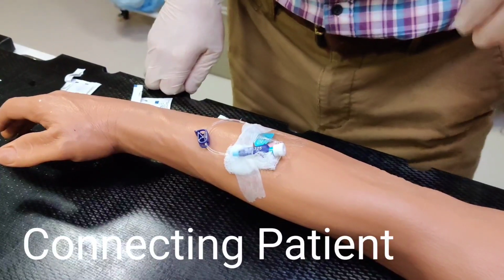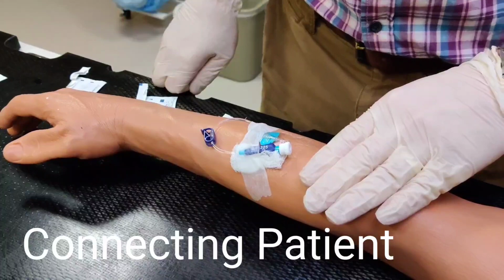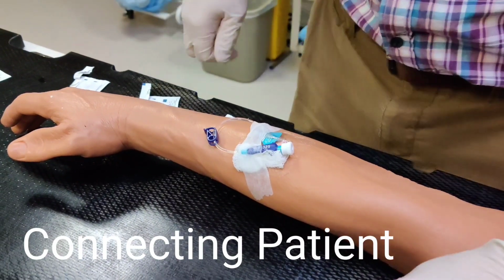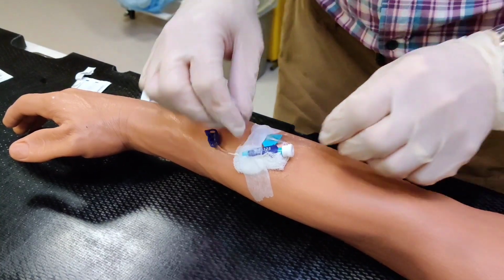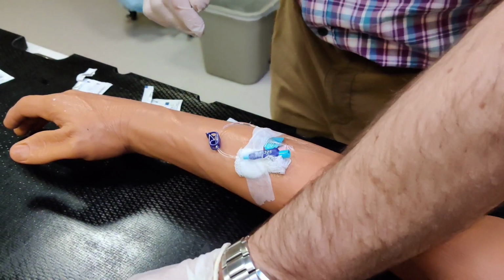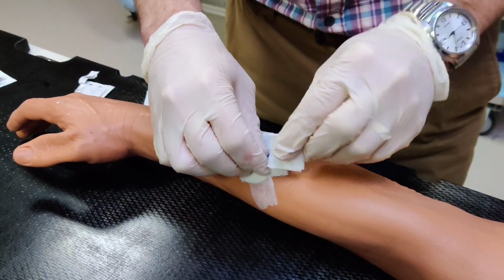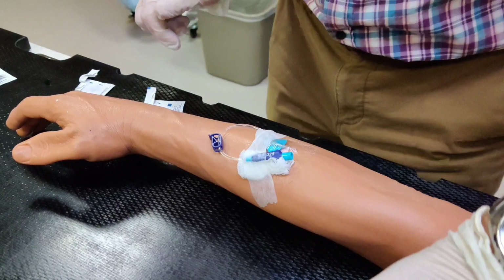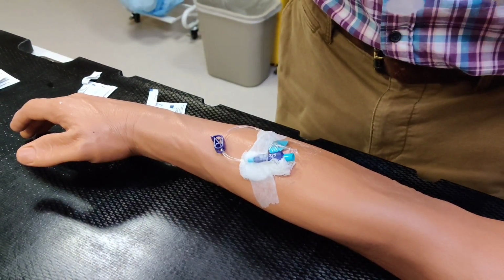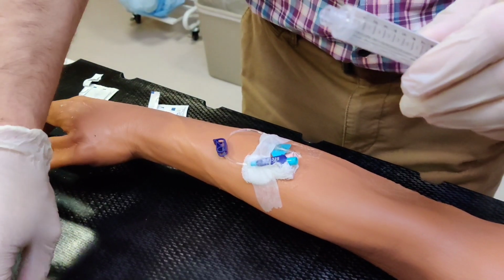This stage of the procedure is we're going to test the patency of the IV that was set up by the RadPro nurse, and we're going to actually connect the IV to the line coming from our contrast injector. So the first thing I'm going to do is remove the white cap on the IV line. I'm going to wipe that down to make sure that there's no risk of infection. I'm going to take my 10 cc syringe preloaded with some sterilized saline, and I'm going to connect that up to the port.